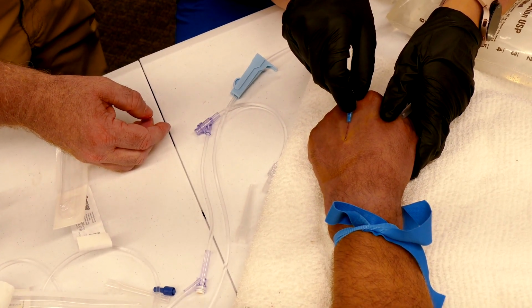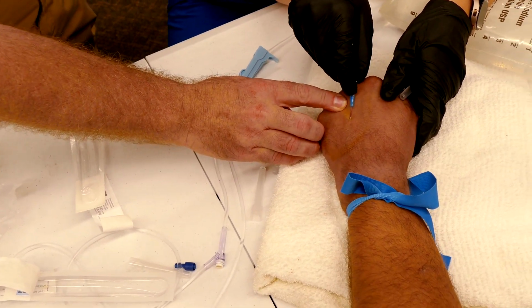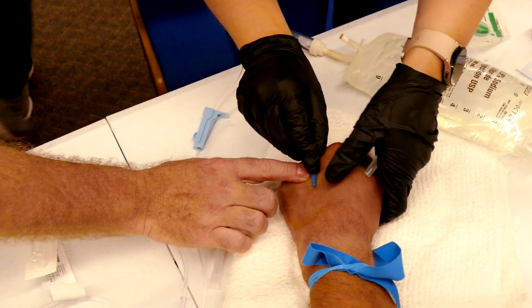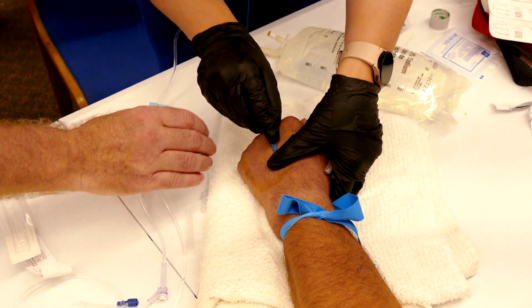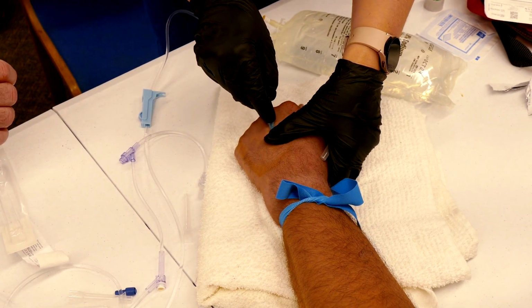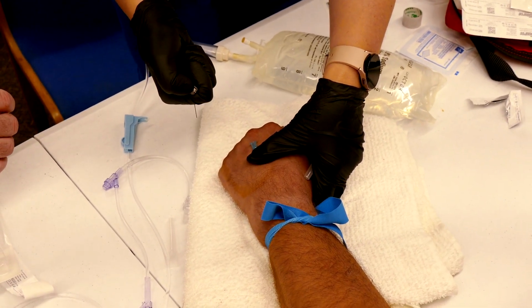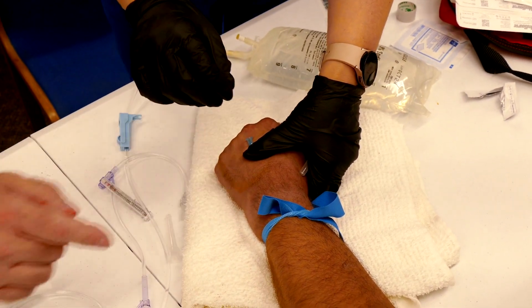Are you doing okay, Joey? I'm fine. Keep going. There. Now advance your catheter. There you go. I don't know if we went through or not. Now get that under control and tamp out at the same time, however you want to do it. Pull back and then hit the button. Keep going, keep going. Button. Oh, she spun it around. There it is, right there. Push, there you go, straight down. And now you want your tubing.